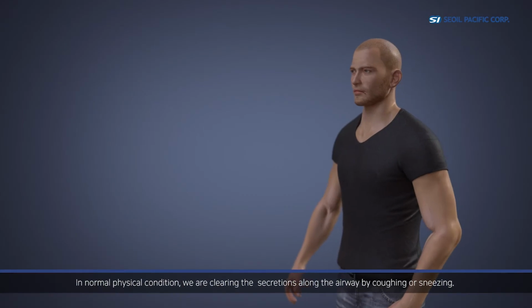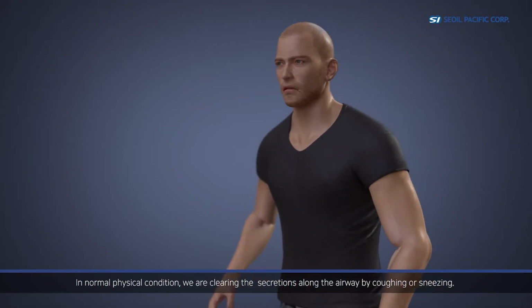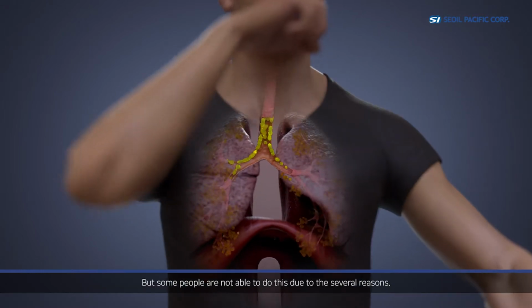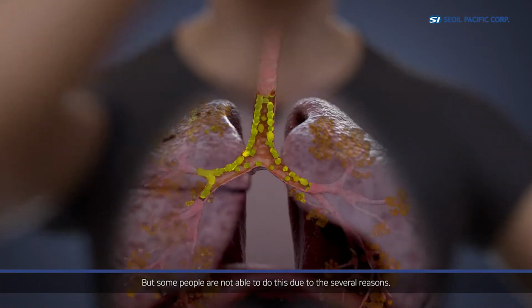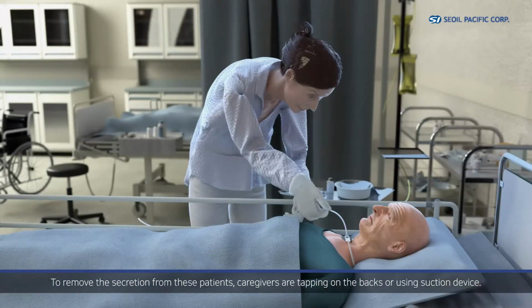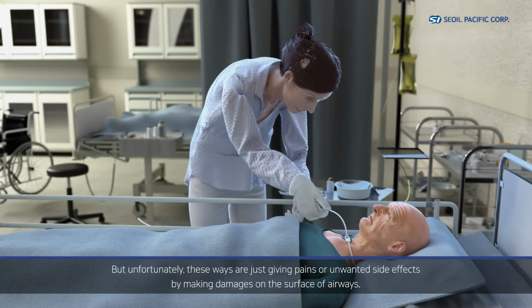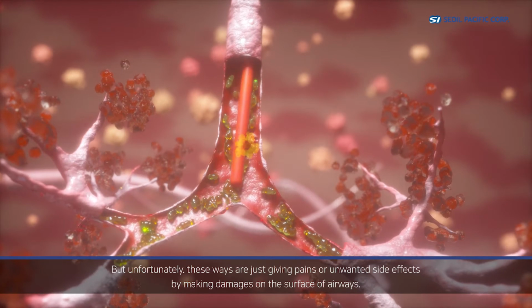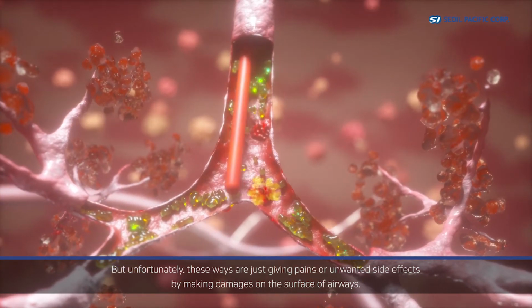In normal physical condition, we clear the secretions along the airway by coughing or sneezing. But some people are not able to do this for several reasons. To remove the secretions from these patients, caregivers tap on their backs or use a suction device. But unfortunately, these ways just cause pain or unwanted side effects by damaging the surface of the airways.